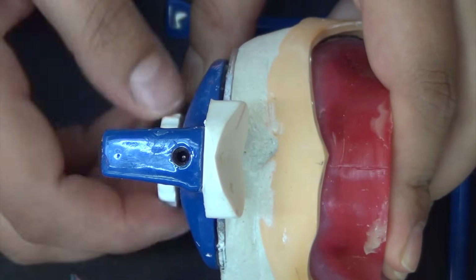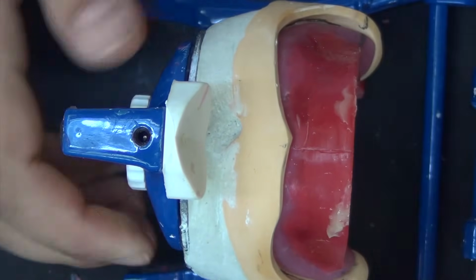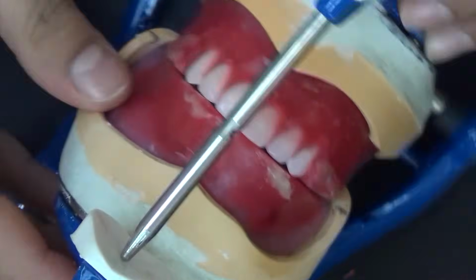You have the midline located with the upper teeth, and you know the minimal overbite and overjet you want to create.